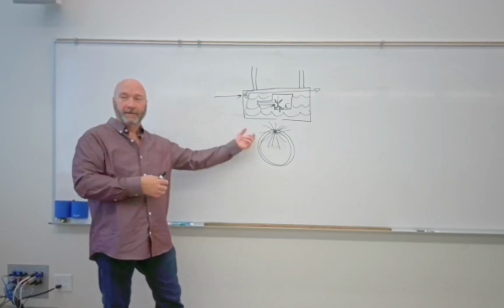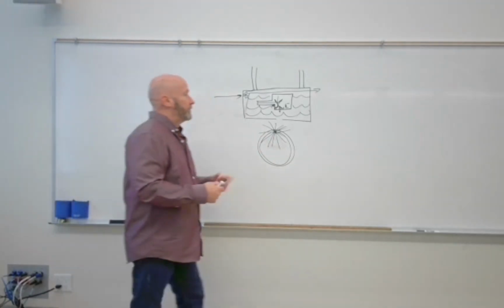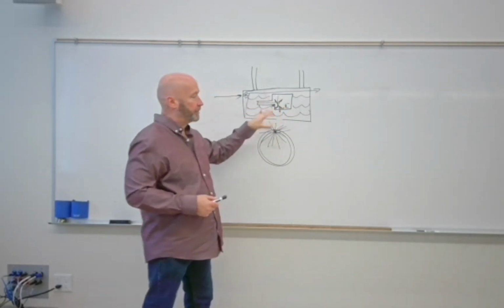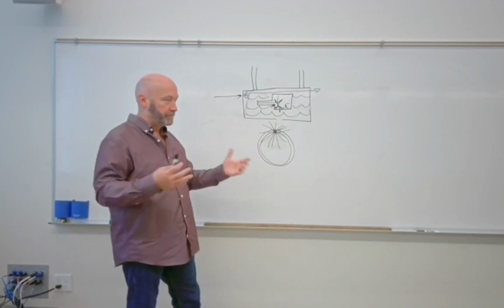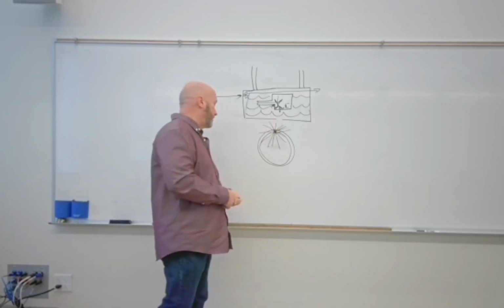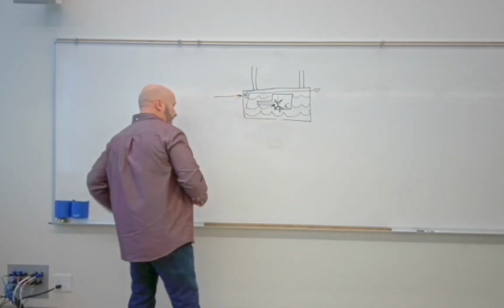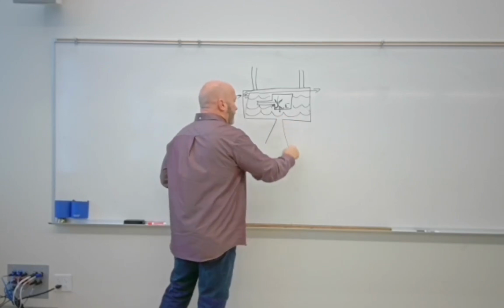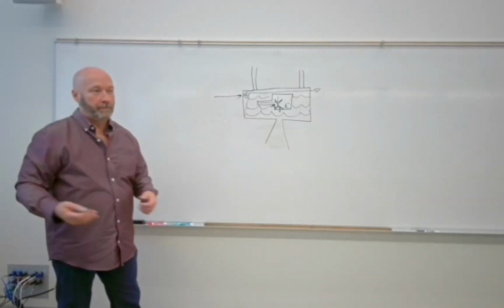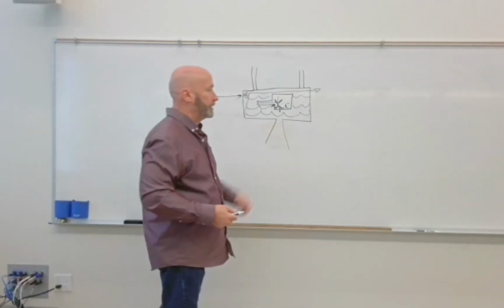Because you're never going to shoot the patient without the collimator housing on. That's the only way that they would see it. So one of the purposes for the protective housing, aside from cooling and protecting the X-ray tube against rough handling, is to limit that isotropic emission to what comes through the window, and that's what we refer to as the useful beam. Even still, we have to have that collimator housing to protect against a few things as well. We'll get to that.